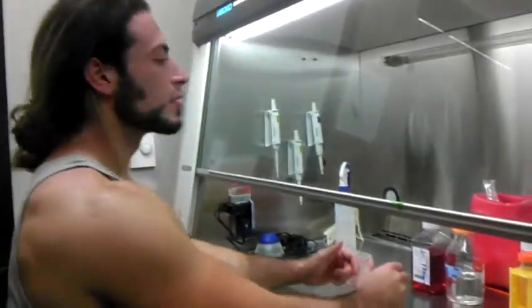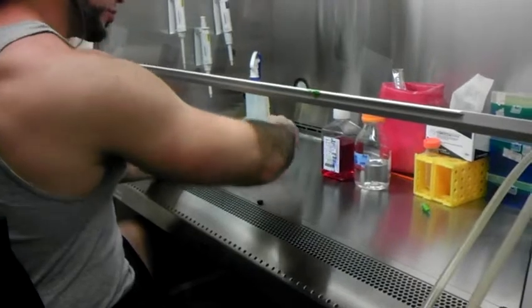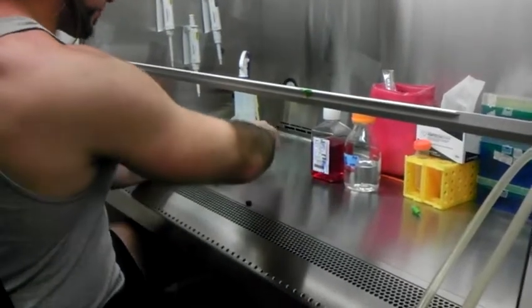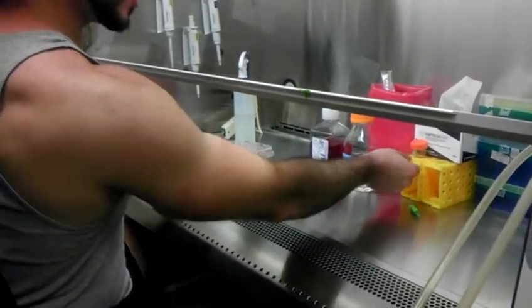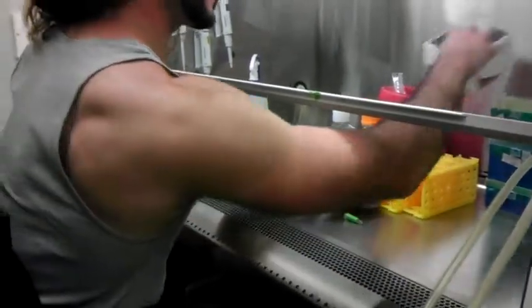Okay, so your first step is you're going to add 28.2 milliliters of the DMEM. To each one of these? No, you're going to want to make it in a conical vial. In a conical? Yep. So let me pull this out a little bit. Yeah, you can take off the thing.